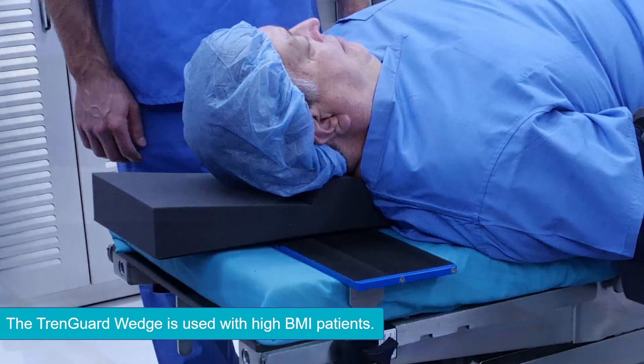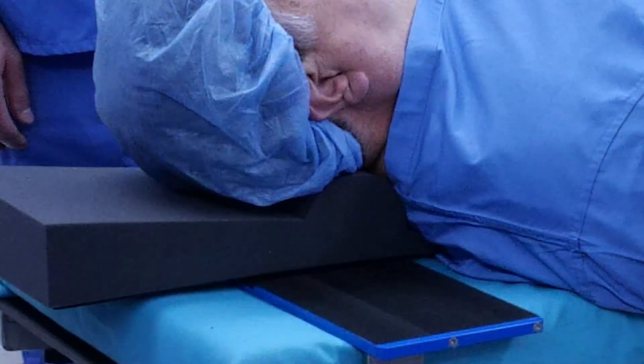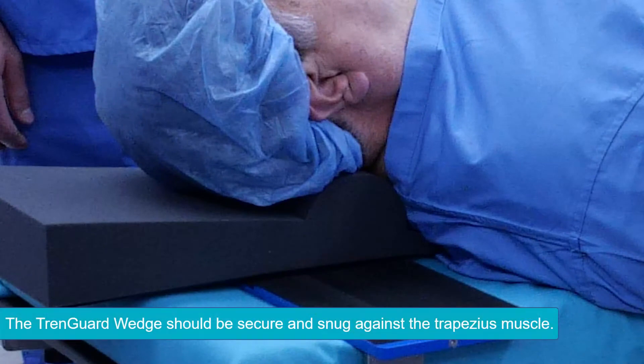This wedge-shaped design supports the head and neck when the patient has limited range of cervical motion. Make sure the bolster is always secure and snug against the trapezius muscles at the cervical notch.